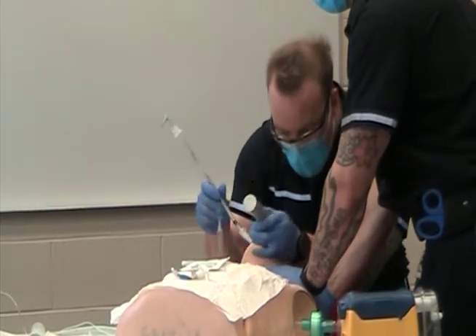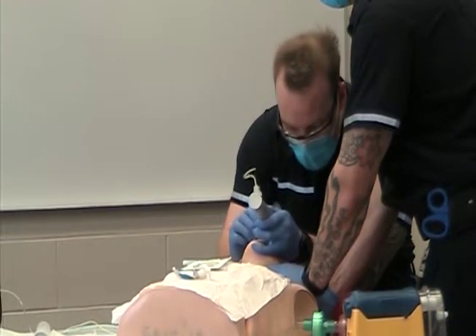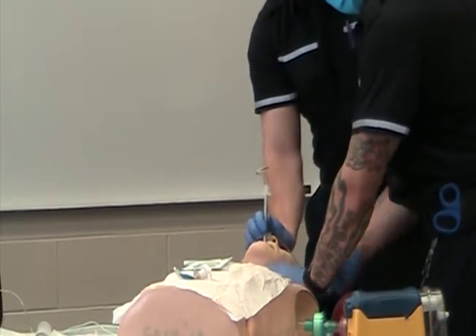8, 9, 10, 11, 12, 13, still at 99%, 15, 16.